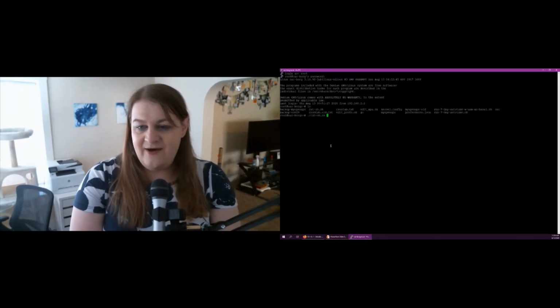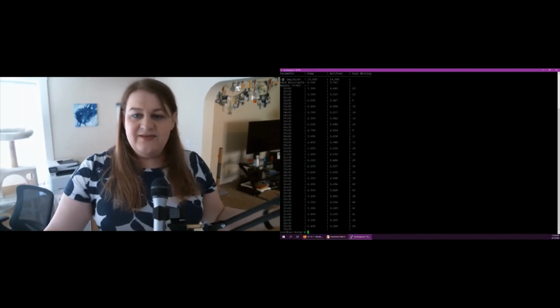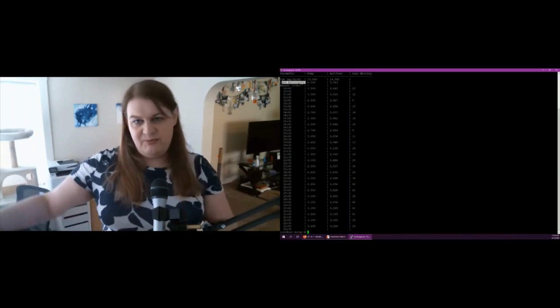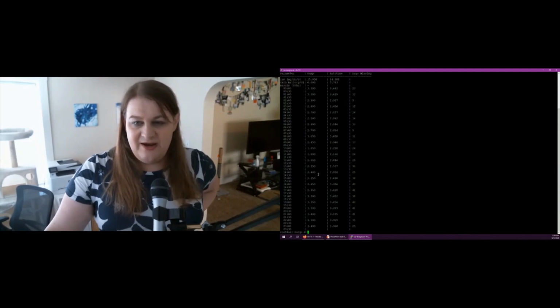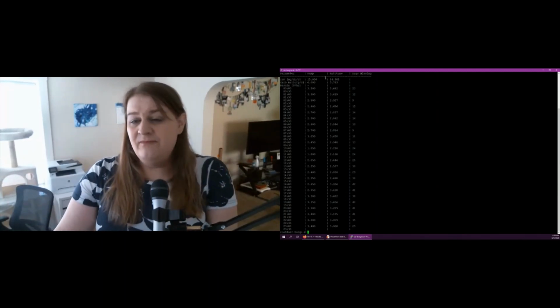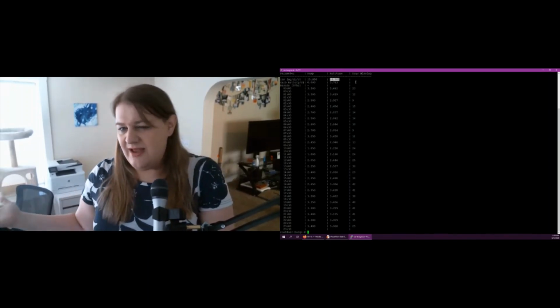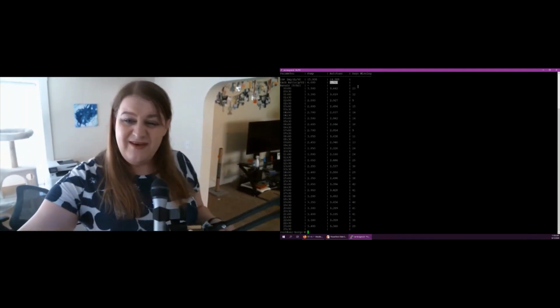So right now, I wrote this little script. It just dumps a text file out. It can read that insulin sensitivity factor, which is the ISF, the carb ratio, which is how many grams per unit, and then all of my basals all day long, which is this first column here. And these are the numbers I programmed into my pump that if nothing else works, these are the amounts it should give me. Auto-tune runs every day. So it says, hey, you're set up for 15. I think you should be 14.988, which is close enough for me. You're 6, you should really be about 5.7.